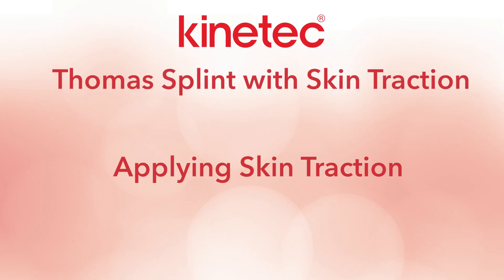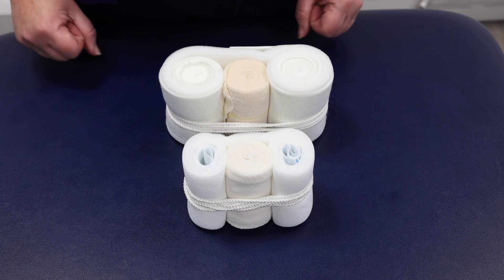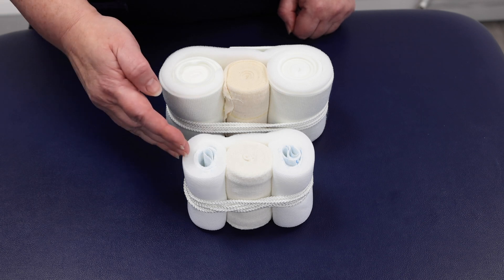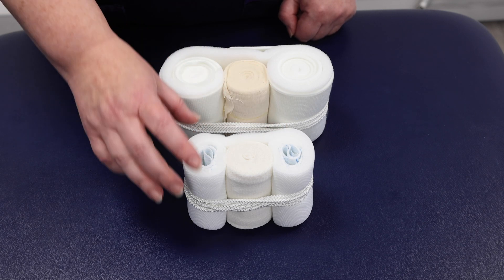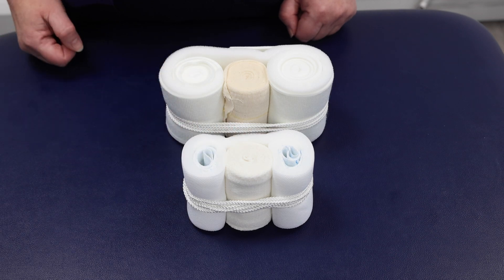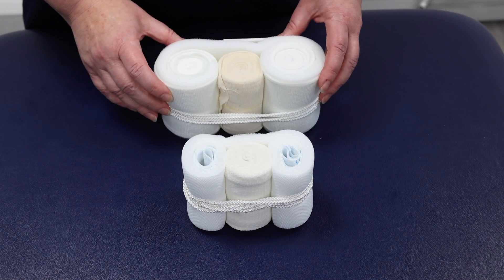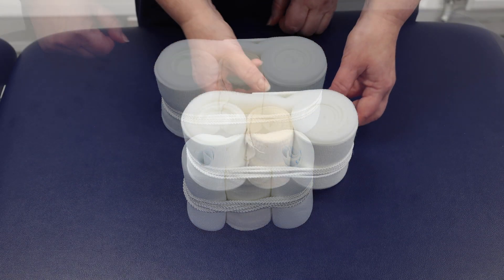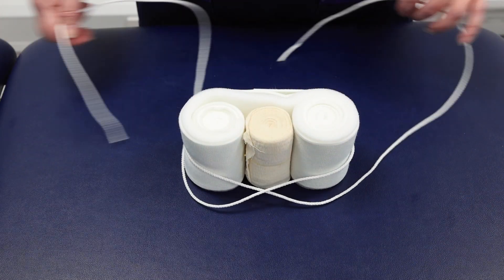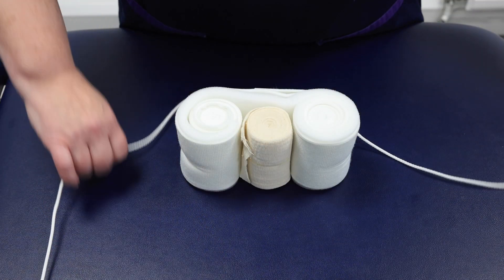Applying skin traction. There are two common types of skin traction kits: adhesive kits, which stick directly to the skin, and foam base kits, which protect fragile older skin. Before application, unwrap the kit and lay out the foam traction strip.